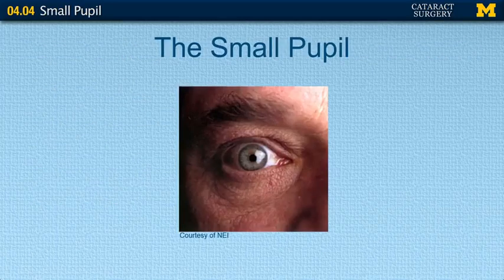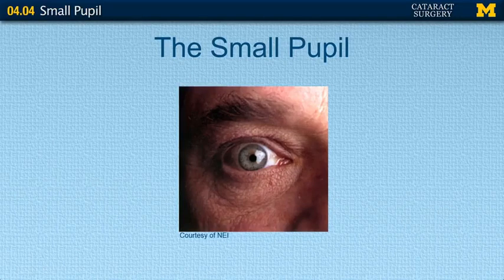A small pupil technically is defined as a pupil less than four millimeters, but really any size pupil where you can't see enough to do the surgery safely can be considered a small pupil.